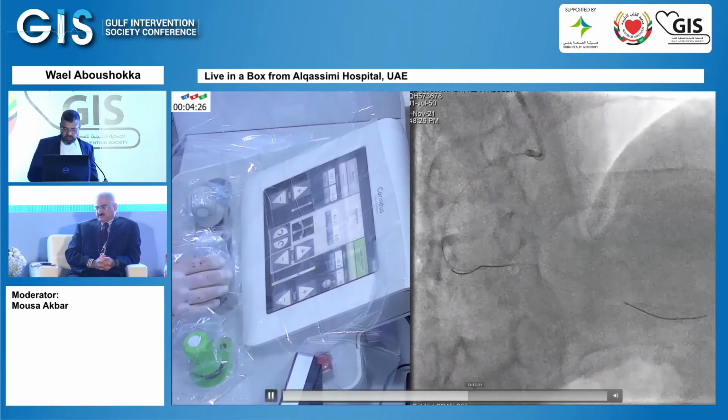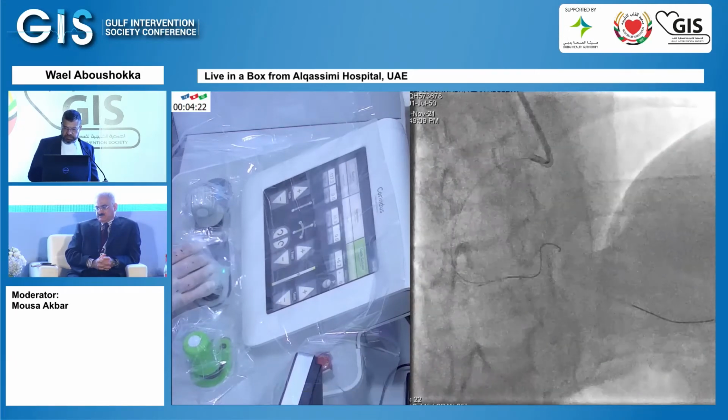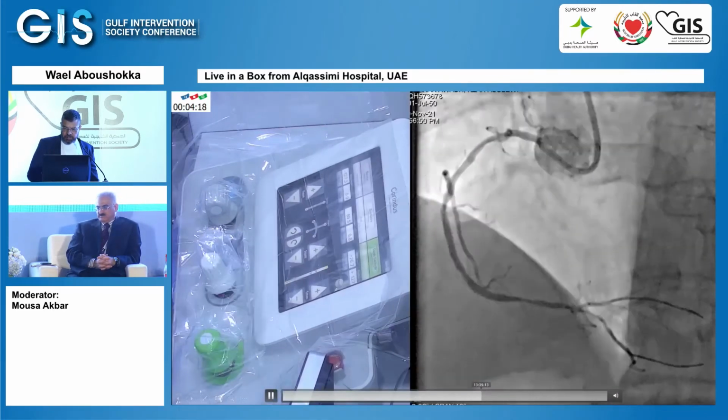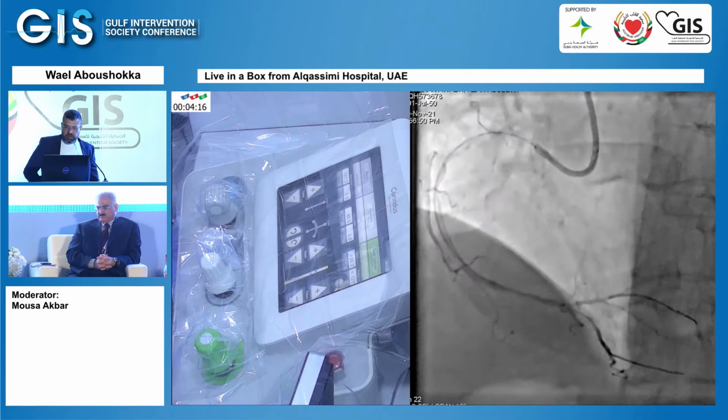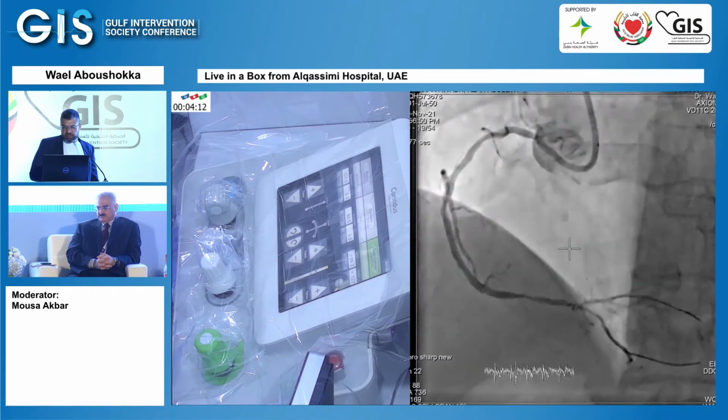For sake of time, we need to try to go to this PLA. Okay, here we are, better, much better.